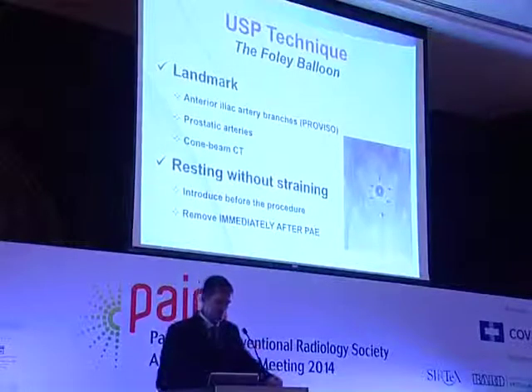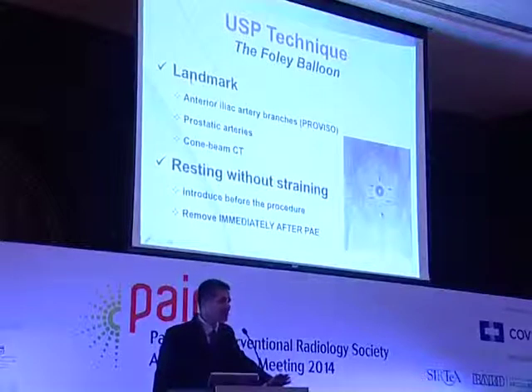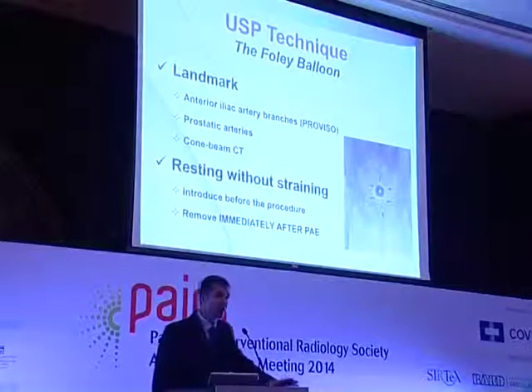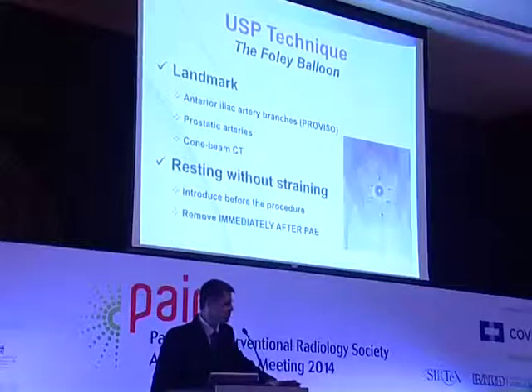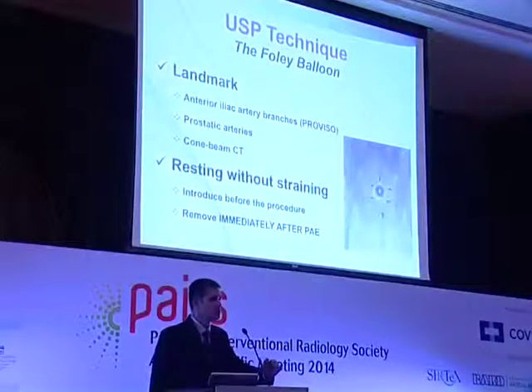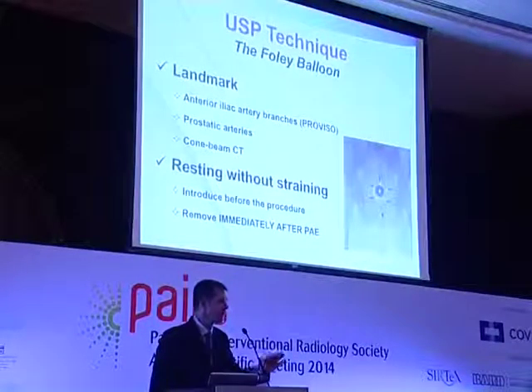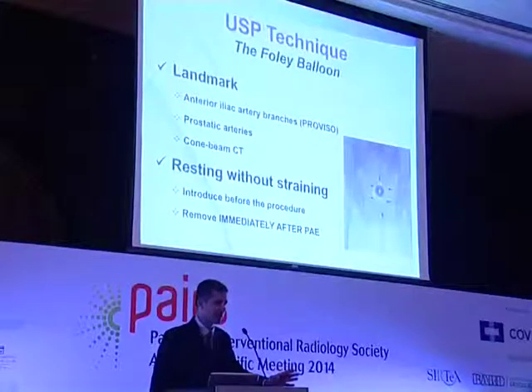And what is it about? It was mentioned by my previous speaker concerning the Foley technique. The Foley technique is very, very useful. For patients without a Foley catheter, we place the Foley catheter immediately before the procedure. We fill the Foley balloon with contrast media, do the procedure, and remove the Foley catheter immediately after the procedure. So patients do not go home with the Foley catheter.